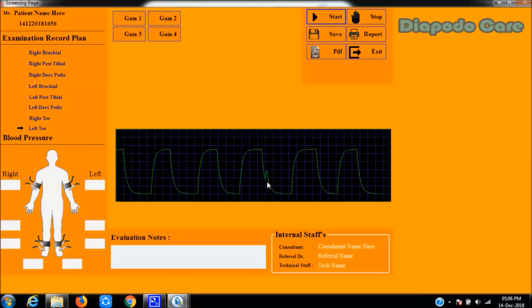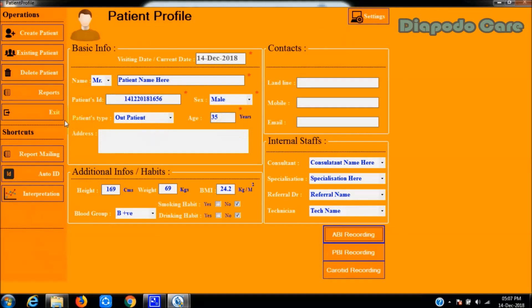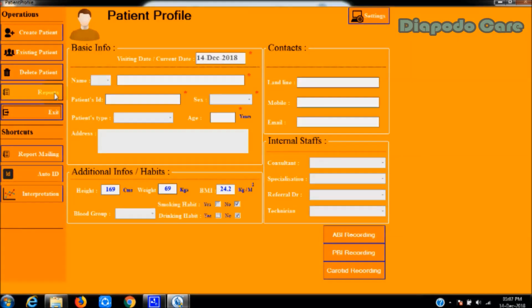Like all right-side screenings, the user must perform the same procedure for the left brachial, left posterior tibial, left dorsalis pedis, and left toe positions. After all spots are recorded, the software will show a notification confirming all spots are recorded. Then enter the systolic BP values in the corresponding text fields as measured. After entering all BP values, click the save button to store the entire procedure into the database. The ankle brachial screening window will close upon successful saving.